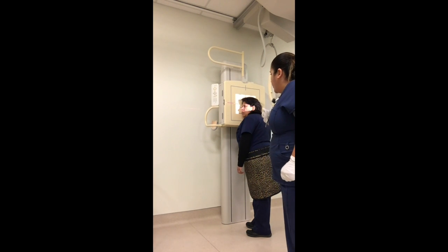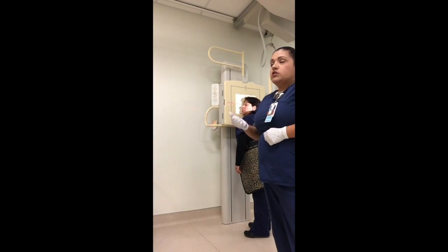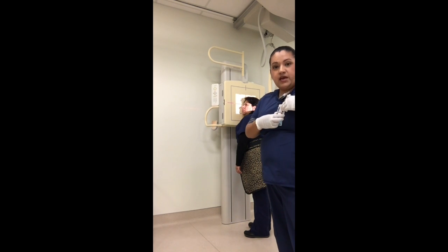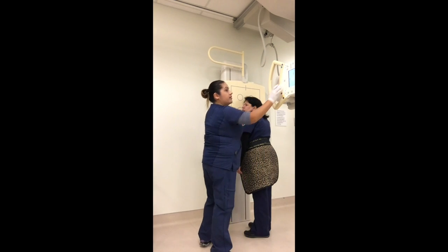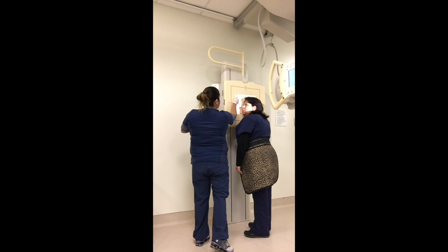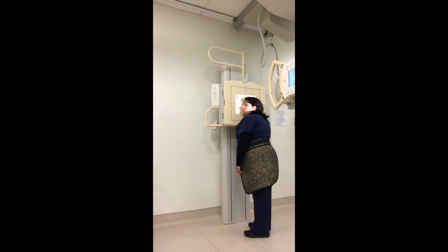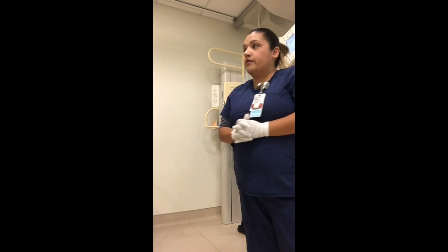My SID is at 40. So the technique I would use for the right lateral is 85 kV at about 18 to 20 mAs, and I put on my right marker to indicate this is my right lateral image. So, Ms. Rodriguez, go ahead and take a deep breath in and hold your breath. Beep! And breathe.